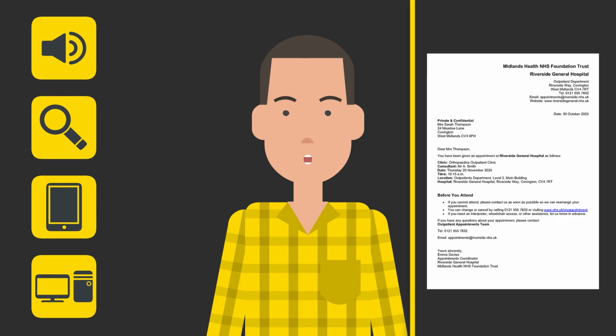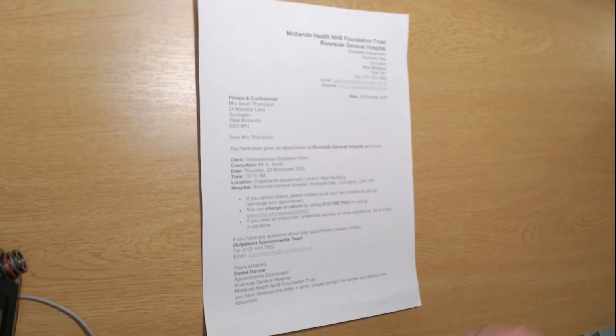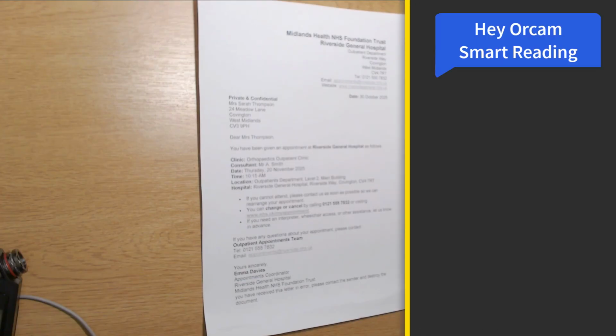So this letter here is a typical hospital appointment letter. And we want to find out what date this appointment is. So to do that, I'm going to enter Smart Reading mode. So I'm going to hold my OrCam above the document, then say, "Hey OrCam, Smart Reading."